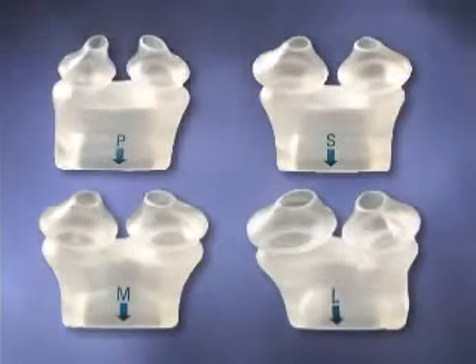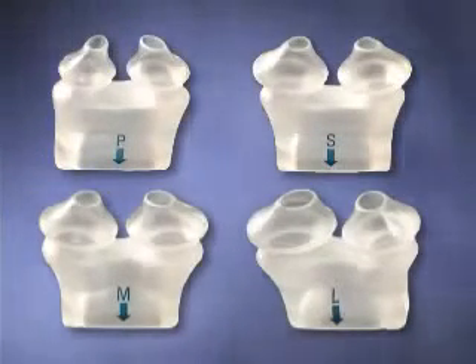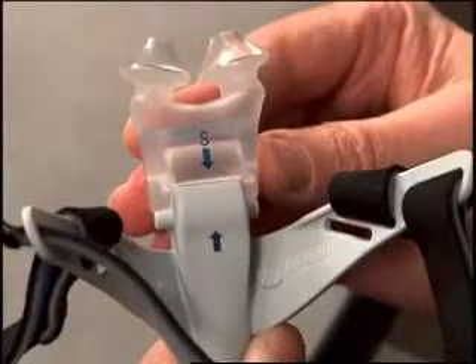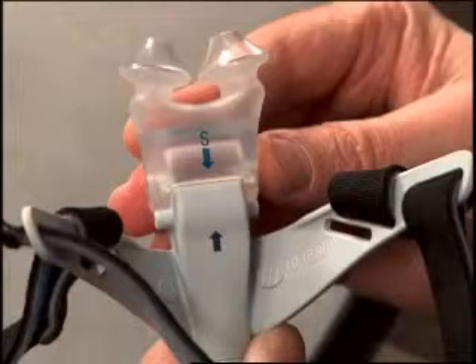The OptiLife patient interface features four cushion sizes: petite, small, medium, and large. The size is indicated on the back of the cushion. Use the arrow below the size indicator and the corresponding arrow on the hub to ensure proper cushion attachment.